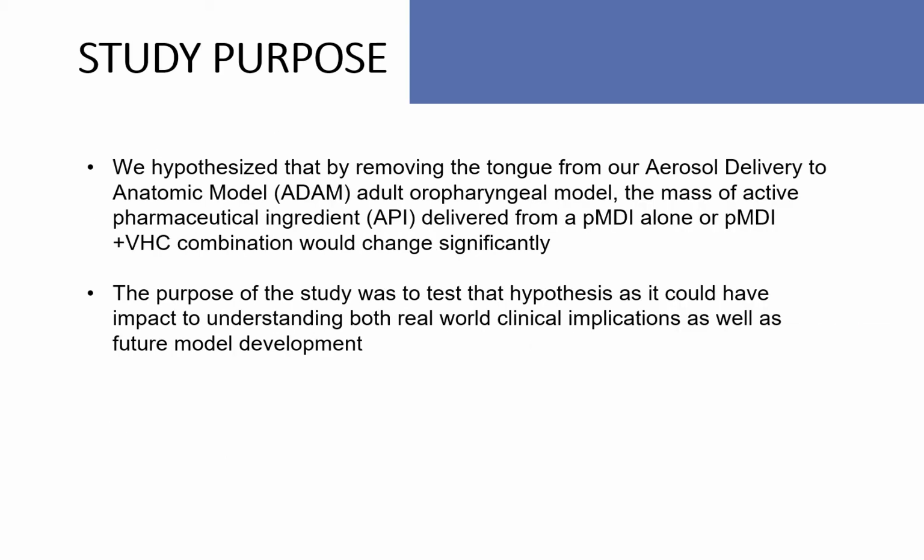We hypothesize that by removing the tongue from our model, an upper airway adult oropharyngeal model, the mass of active pharmaceutical ingredient from the MDI alone or the MDI with VHC combination would change significantly. So the purpose of our study was to test that hypothesis, as it could have an impact to understanding both real-world clinical implications as well as future model development.